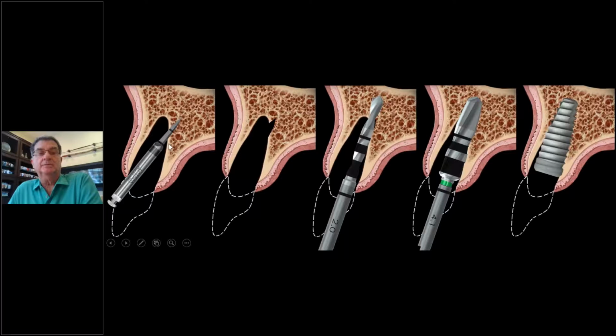And once you break through the bundle bone up here, the dense bone here, now you're going to be able to engage all this bone, but you can't go at the same angle. That's the number one mistake of creating recession down the road. Anything too far forward and too close to the buccal plate that he showed so well. So now we're going to re-angle everything to come out the cingulum, as you see here. Go in that opening and come out the cingulum and aim at the cingulum with your 2 millimeter twist. Then you go a little wider and of course place the implant.